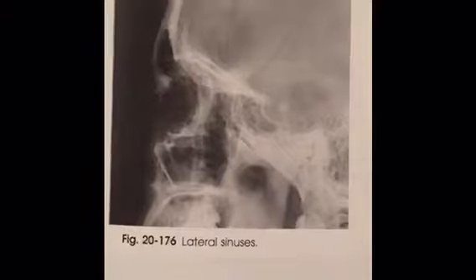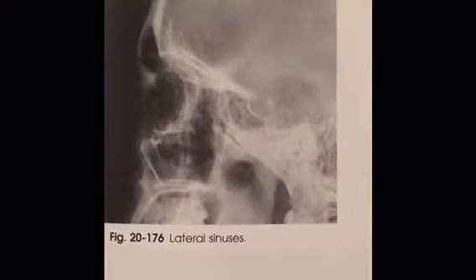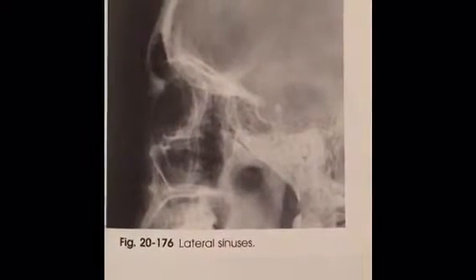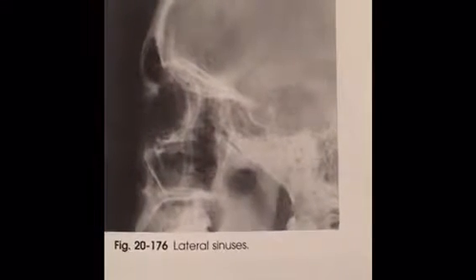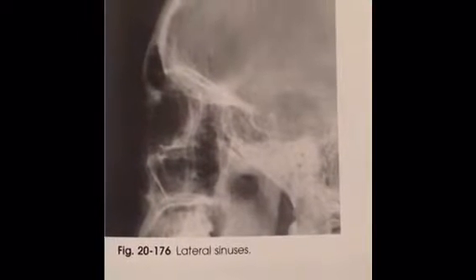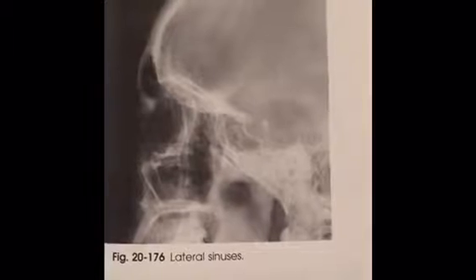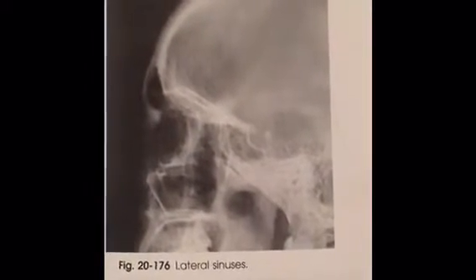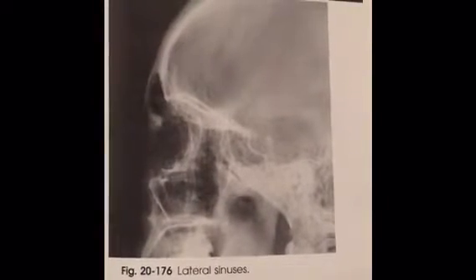So now that we finished our projections for the sinuses, we're going to go ahead and evaluate some of the images. The first image that we're going to evaluate is going to be our lateral projection. The evaluation criteria for this projection is you want to see all 4 sinus groups, but the sphenoid sinus is best demonstrated. No rotation or tilt of the sinus anatomy, and this is demonstrated by the sella turcica in profile, superimposed orbital roofs, superimposed mandibular rami.